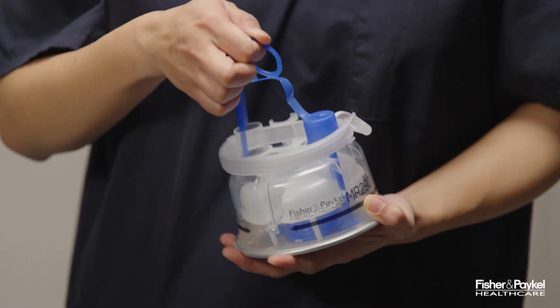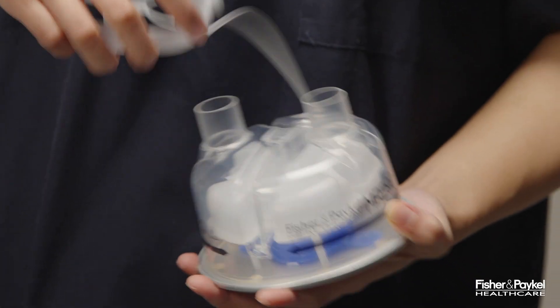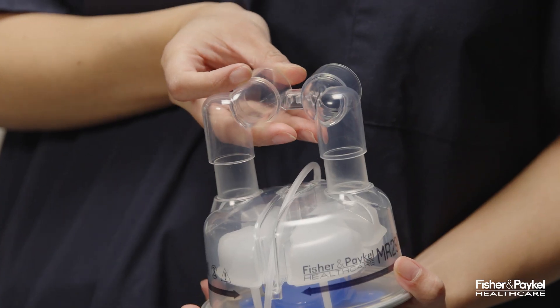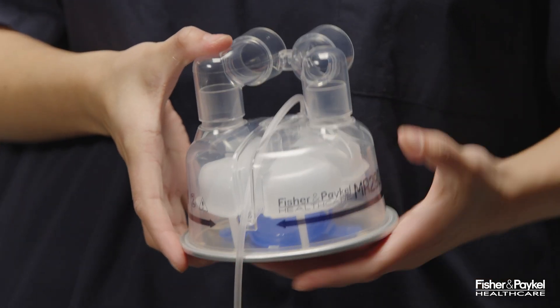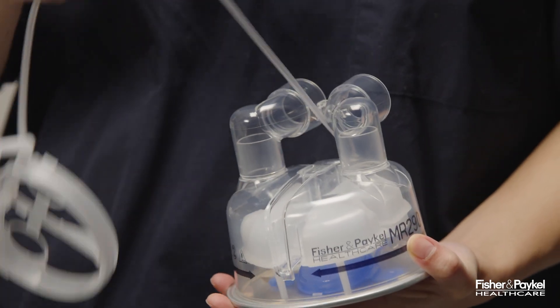Remove the blue port caps from the MR290 autofill water chamber and the bracket holding the water supply tube. Fit the adapter over the two vertical ports on the chamber and push on fully. Clip the water supply tube into position.